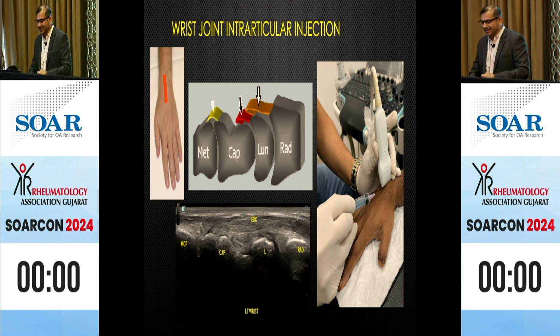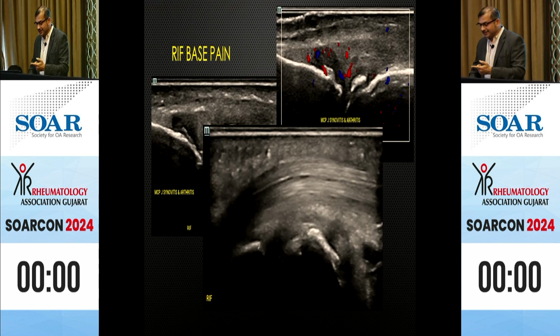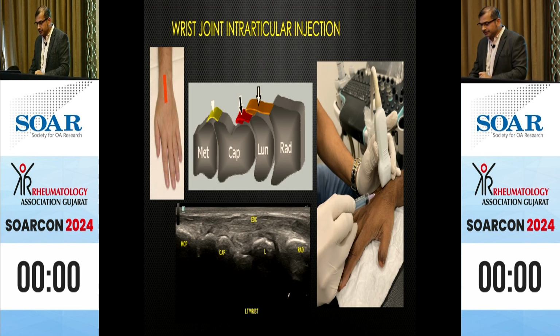Done. So this showed inflammatory synovitis and arthritis. So the important thing to convey was that this was not a trigger finger, but MCP joint osteoarthritis, maybe post-traumatic in nature, because otherwise it's very rare. And that's why imaging is needed prior to this.